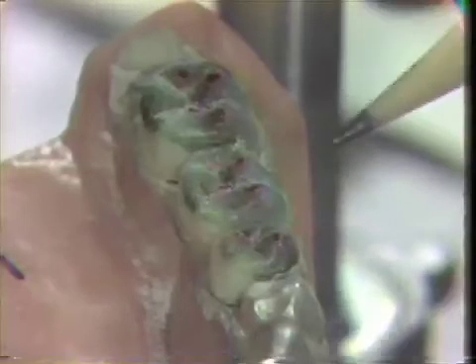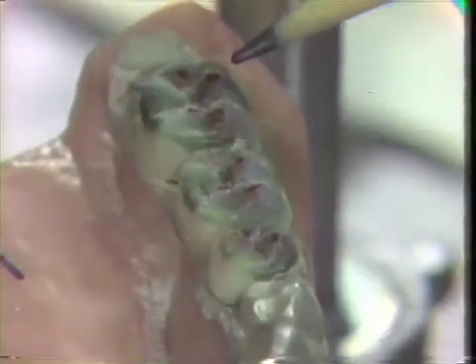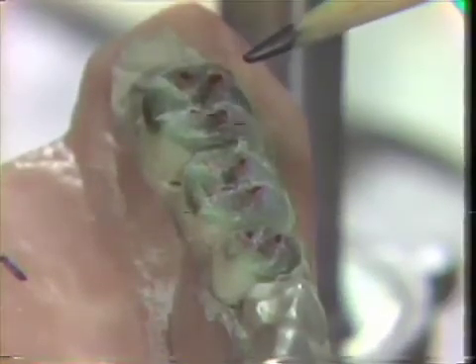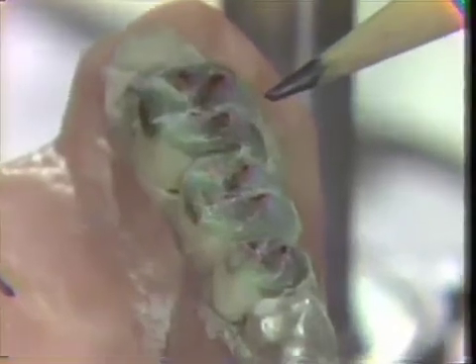We've gone ahead now and completed step number 5, the triangular ridges, and we've again dusted the surface with zinc stearate, closed the articulator to ensure that we still have our centric stop areas that we started with, those areas that are in red. We'll now go on to step number 6, the final step in our waxing procedure, and show the development of the supplemental grooves and the supplemental ridges. Supplemental grooves run from the central developmental groove and flank each of the triangular ridges.